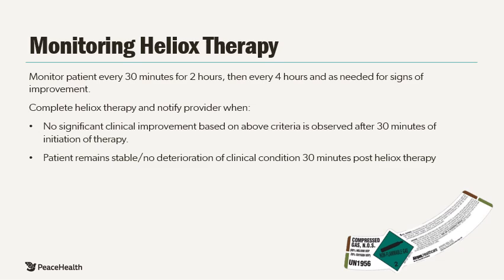We're going to complete Heliox therapy and notify our physician when there's no significant clinical improvement based on our above criteria observed after 30 minutes of initial therapy. We also remove it if the patient remains stable or no deterioration of clinical conditions in 30 minutes post-Heliox therapy.